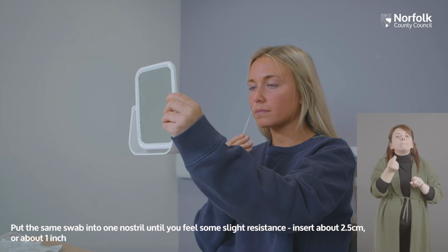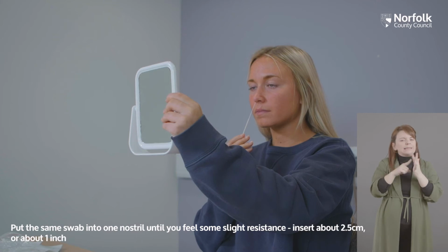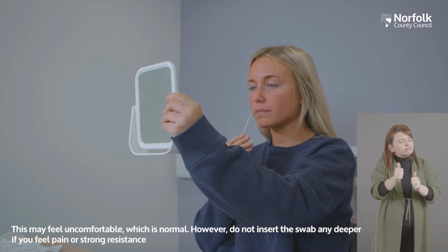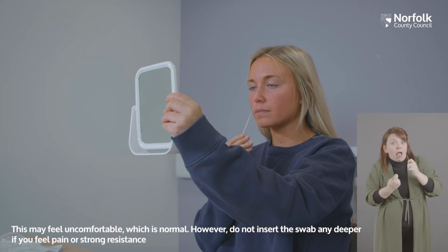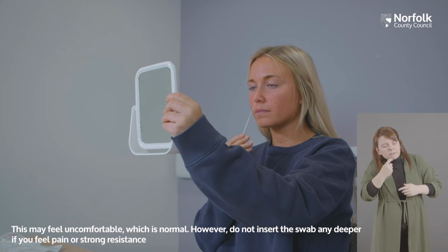Put the same swab into one nostril until you feel some slight resistance. Insert about 2.5 centimeters or about 1 inch. This may feel uncomfortable, which is normal. However, do not insert the swab any deeper if you feel pain or strong resistance.